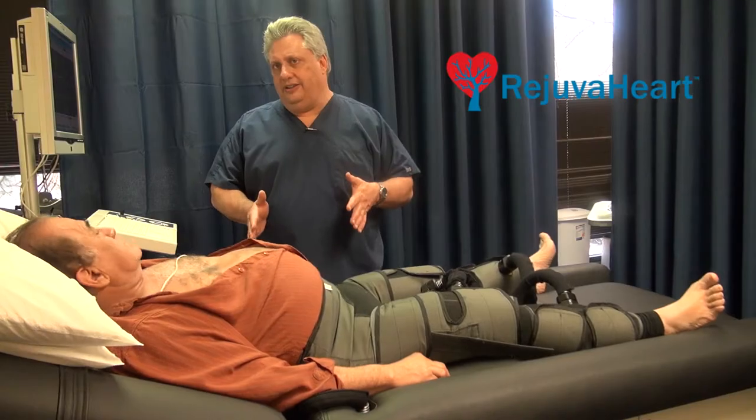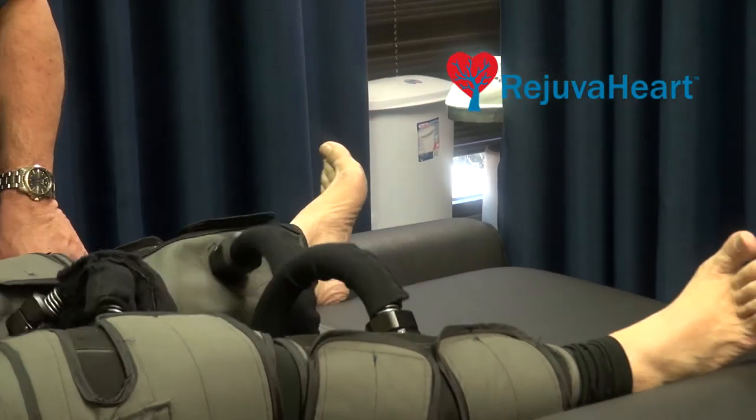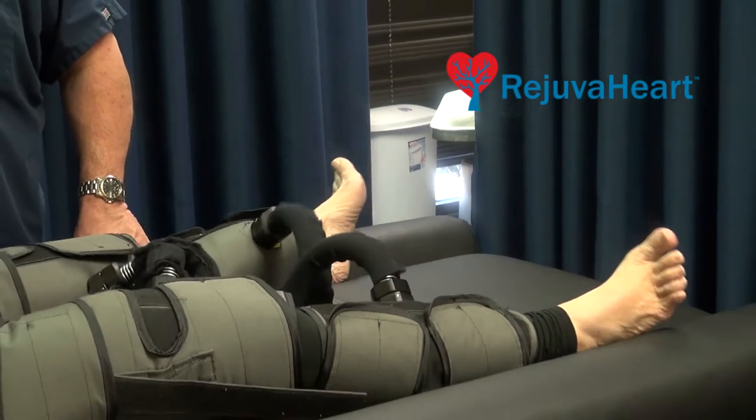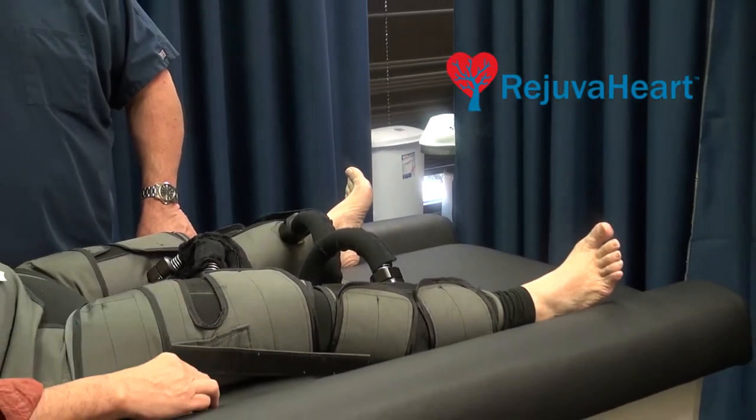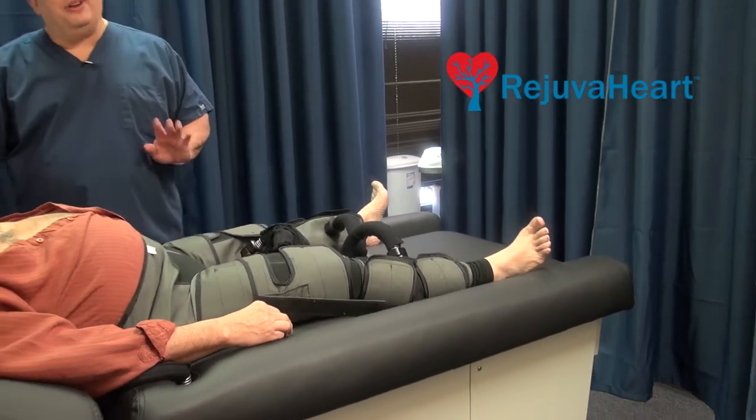How is the blood pumped? By compression of the calf, the thigh, and then the abdomen. And the blood is literally thrown into the upper body and the lower body, therefore creating the collateral circulation.